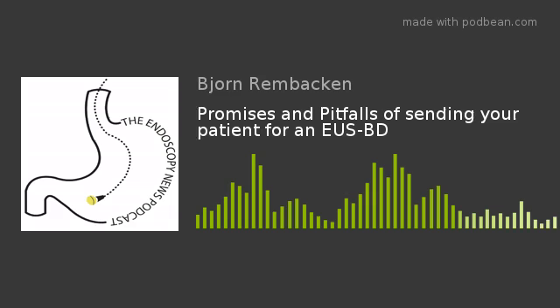Occasionally, it is used for patients who have very difficult and impossible biliary cannulation. We are starting to use it after extensive discussion with our pancreatic surgeons in patients who are potentially operable, because again, it's a very quick procedure, it's very safe, and it leads to a much quicker resolution of jaundice and cholangitis.